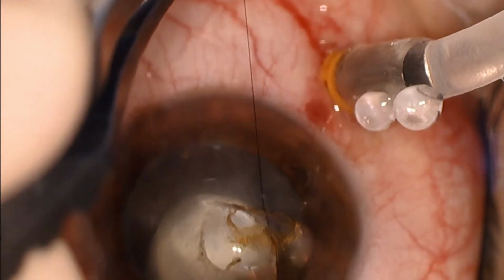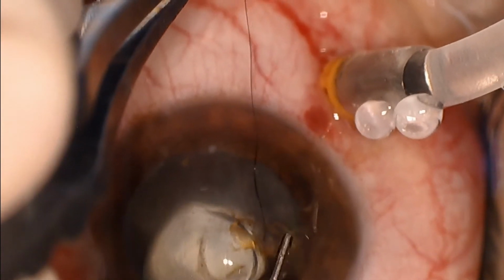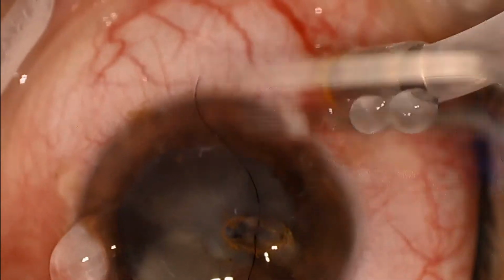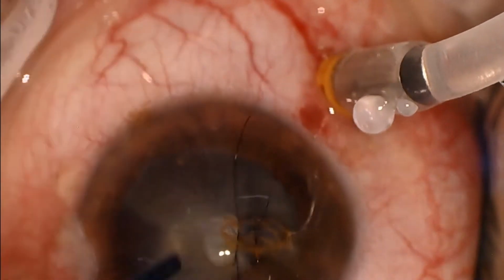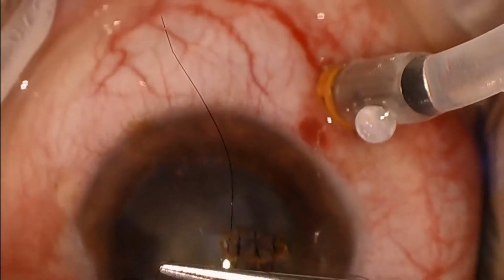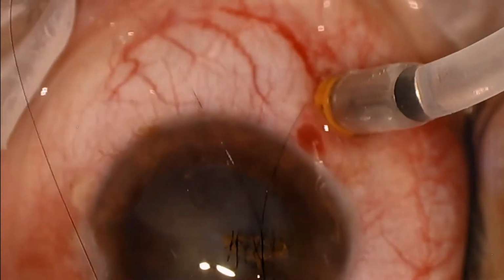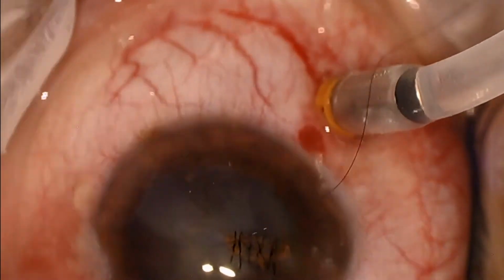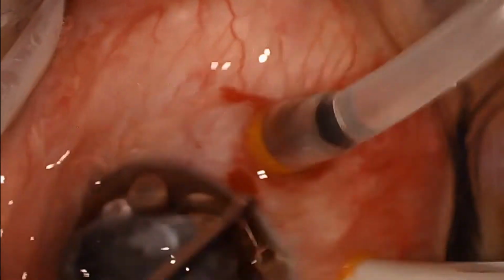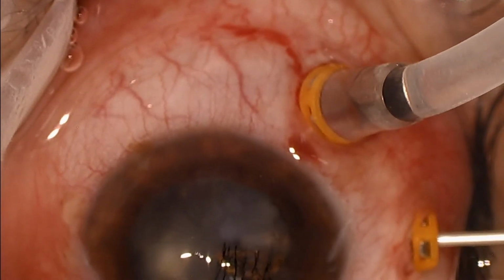And we'll speed it up here a little bit for the closure. You can see also that the nail has left behind some rust in the cornea, but at this point we'll just close the wound and worry about that aspect of it. At this point I have no idea how many sutures are going to be required to close the wound, but at first I'm just trying to get this to be relatively watertight. But as you can see, when I put in the trocar here, still quite a bit of vitreous is being expressed. So this wound needs some more closure.